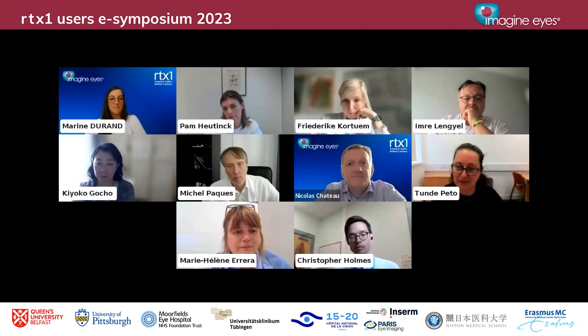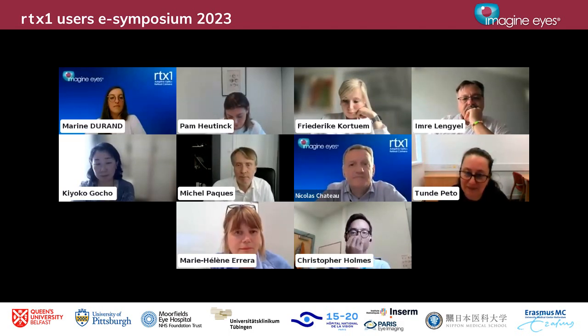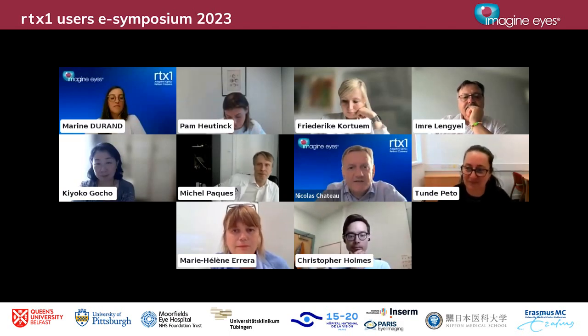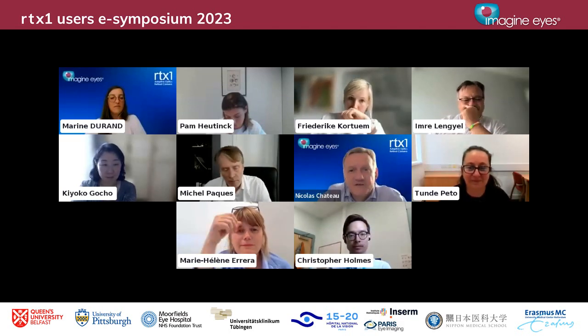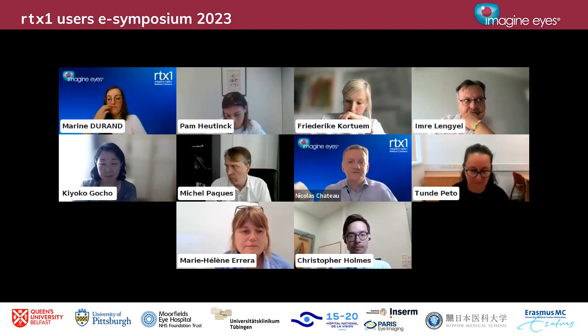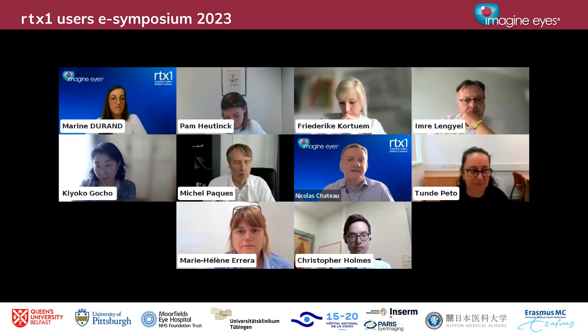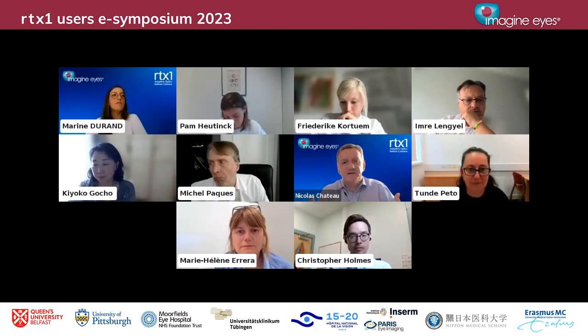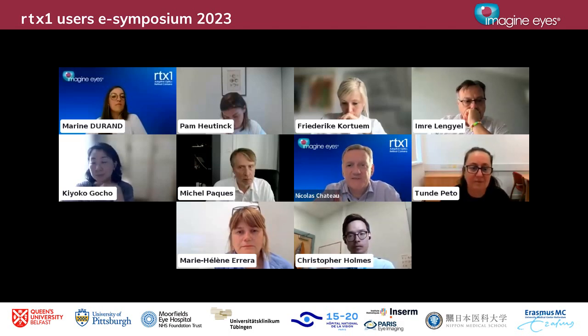Yeah, so I think that goes into, and then I hand over to Marie-Hélène, the question from the audience: how could we capture the RPE layer? That's okay. And I see Michel is probably going to help me answer the question. When you use the system with the TFI option, you can take the regular photoreceptor picture focusing at the photoreceptors, and then you switch to the TFI illumination and take a picture with the same focus. This is where you have the best chance to be in focus with the RPE.